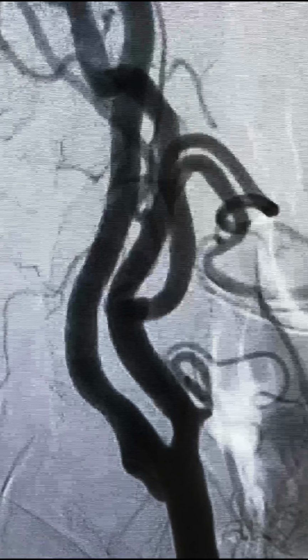This is a real picture. This is reality. You are replacing the entire column of blood in the artery with contrast. What you see as black is actually the contrast. When you give a forceful injection, you replace the column of blood with contrast, and that is imaged. So whatever is the column of blood is seen in the image. That is the advantage of doing a digital subtraction angiography. So what have we concluded by this angiogram? The patient does not have a significant carotid stenosis.